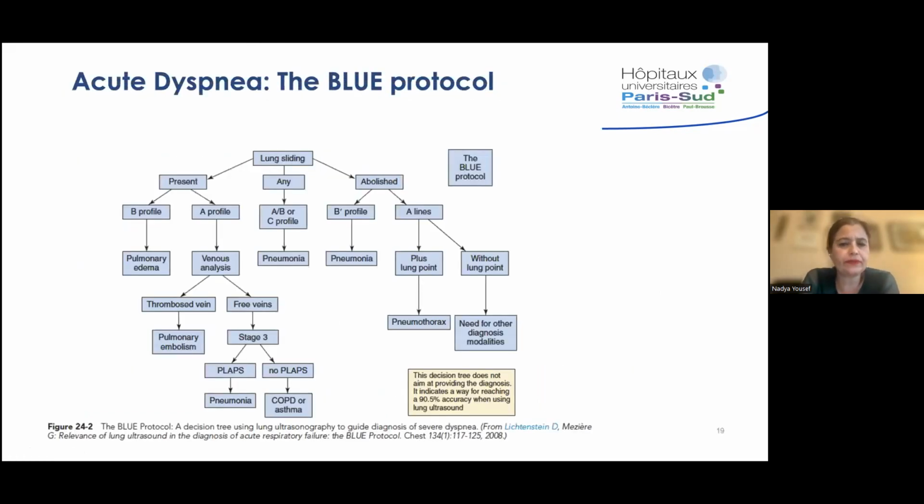One of the first persons to integrate lung ultrasound into more general protocols is Daniel Lichtenstein. Daniel Lichtenstein is the father of lung ultrasound, and the way he has of really seeing patterns and putting these patterns into algorithms, simple for the clinician, easy to learn, and very logical, I think is a major, let's say, I almost used the word breakthrough, because it's possible. What we need as clinicians to do is ask a specific question.